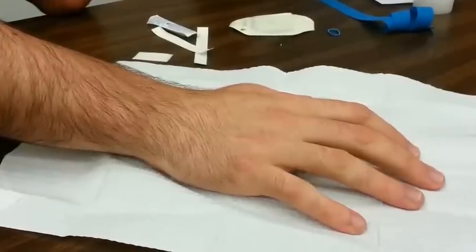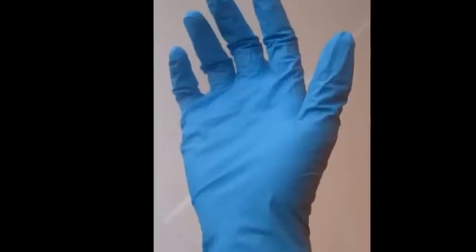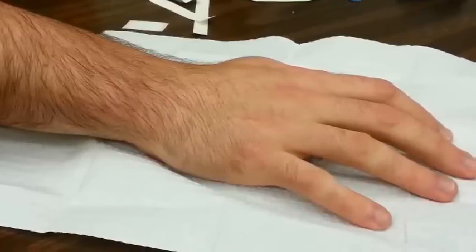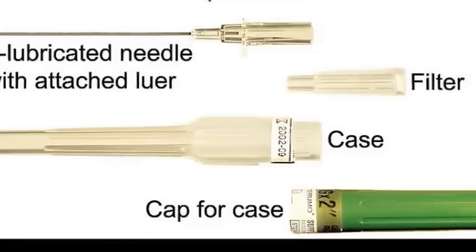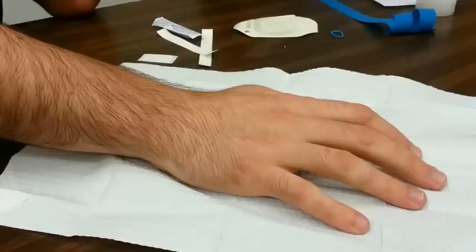You'll want to have all of your supplies ready before jumping in. The supplies that you will need include gloves, a beveled needle with catheter, an IV start kit which typically includes a tegaderm, gauze, a skin prep cleaning agent, tape, and a tourniquet.